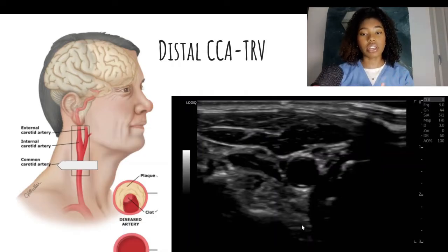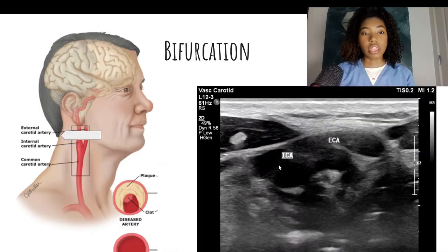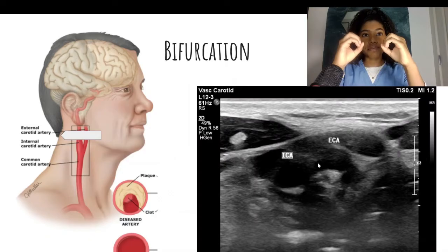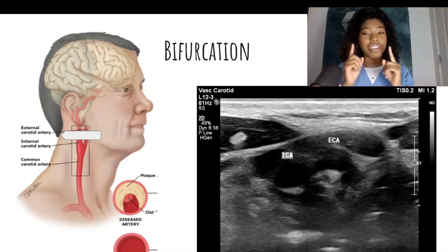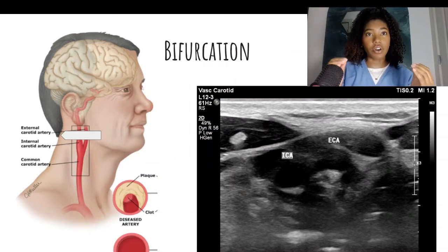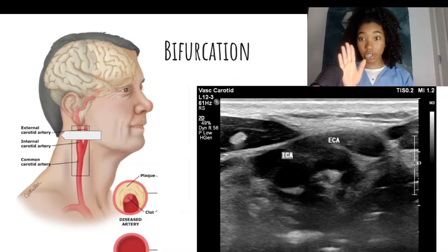That is where I image the distal common carotid artery. Next, I image the carotid bulb where the artery appears as an oval, then move more superiorly and image the bifurcation where that oval turns into two separate circles. Now, this is where it gets tricky for many people — differentiating the ICA from the ECA. The ECA, the external carotid artery, will be on the side closest to the patient's face, generally speaking. Not always, but generally speaking.